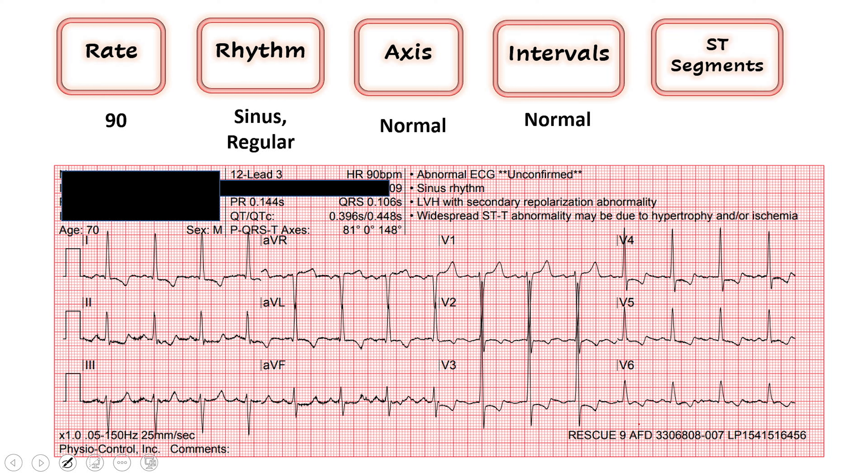Where this EKG gets very interesting is when we look at the ST segments. I always start with leads 2, 3, and AVF — our inferior leads. They're contiguous leads. Looking at ST segment elevation, ST depression, T wave inversions — anything that would signal ischemia. Here we see, looking at the TP segment, there may be a little bit of ST depression in lead 2. I don't quite see it in lead 3, maybe just a hint of it in AVF.